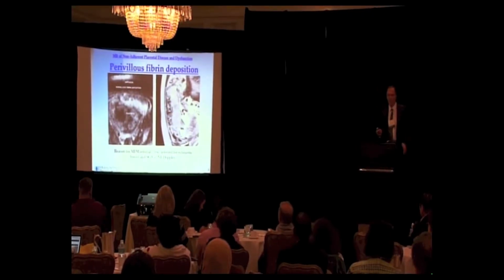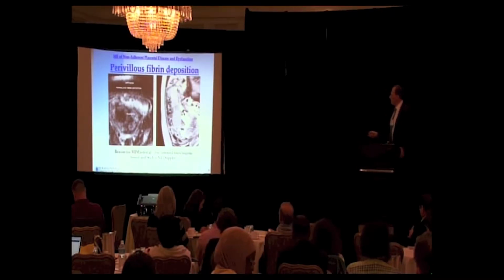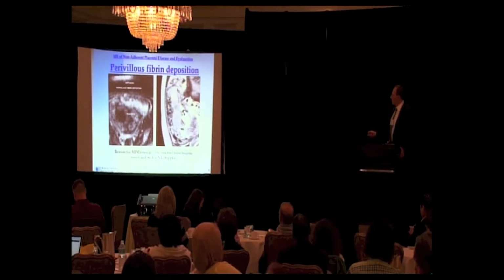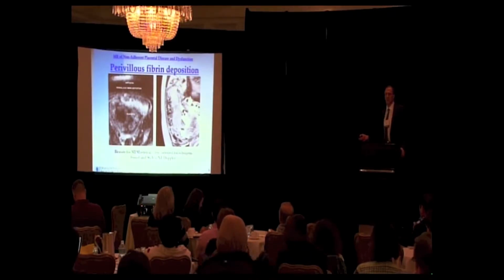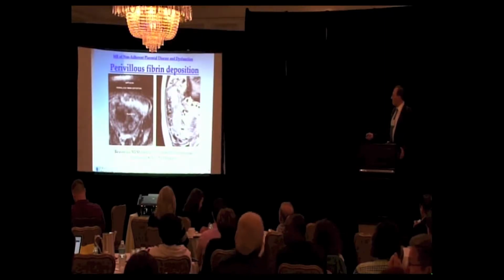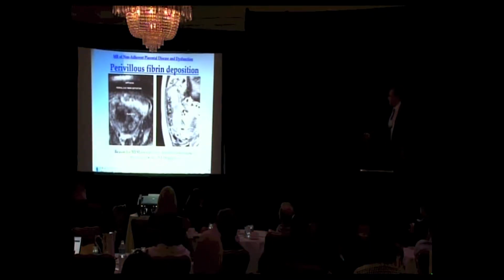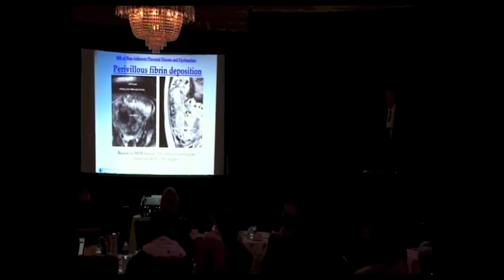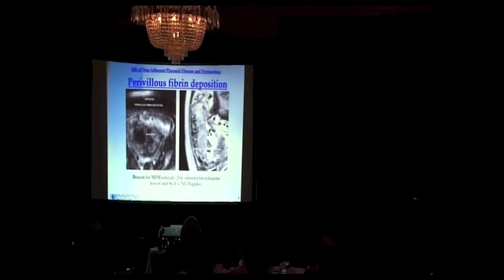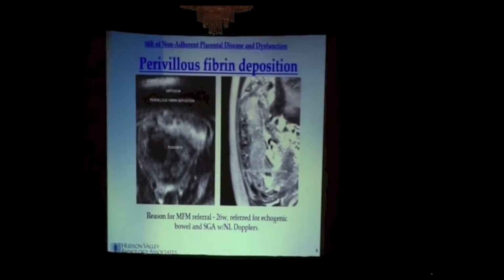The MR lingo that we use, there's T1, there's T2, there's diffusion weighted imaging. But this is what normal placental tissue looks like. Could we turn down the lights a little bit, maybe? Dim the lights, please. This is a homogeneous normal T2 placenta. And on this sequence, we have this thick layer of dark tissue. And on the diffusion-weighted sequence, we see this undulating, thick, dark basal plate. And this represents dysfunctional placental tissue, fibrosis, calcification, but basically placental tissue that will be ineffective in oxygen transport.